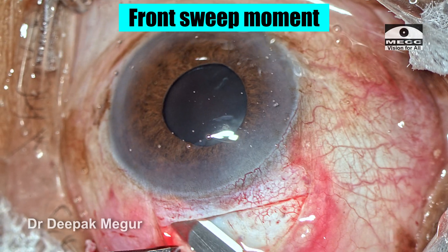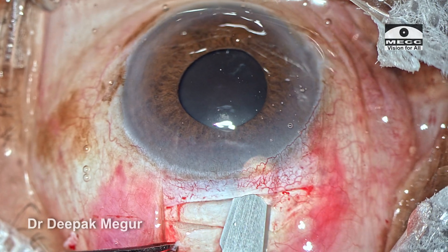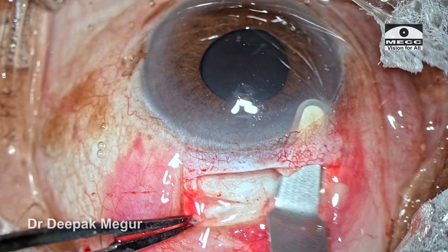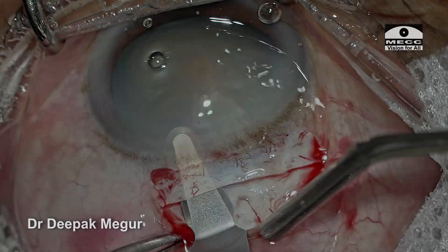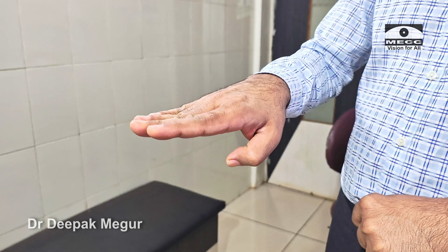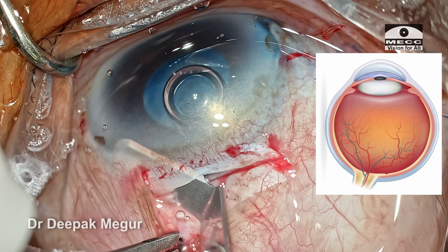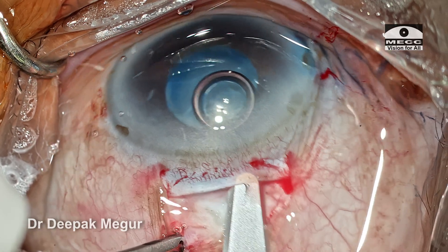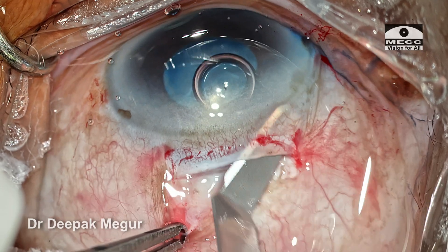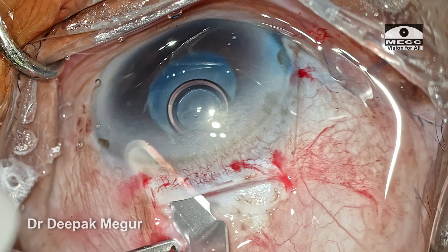There is another variant of the sweeping movement for the lateral extension of the tunnel — the front sweep. In this case, the blade moves from the sclera forward into the cornea, hence the term front sweep. The front sweeping motion is continued until we reach the lateral end. It is up to the surgeon to choose either movement for lateral extension. I prefer the front sweep, but most of my trainees are more comfortable with the back sweep. An important concept: during lateral extension, the blade is tilted sideways as the sweeping movements are done, to respect the global curvature which changes as we move laterally, since the globe is spherical.